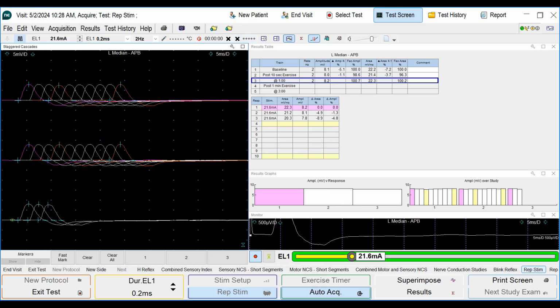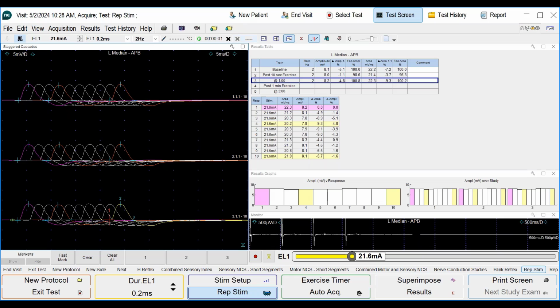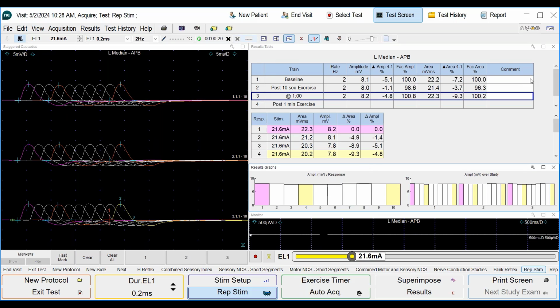And here we have next. You can see I'm conducting this webinar and doing the study at the same time, and it's all possible because of automation. I don't have to pay attention to clocks or stimulus intensities or other things. Once it is set, it's in kind of an autopilot. You can also put comments if necessary over here from the drop-down list: normal, abnormal, etc.